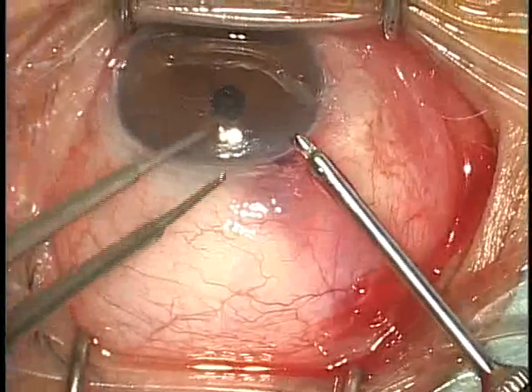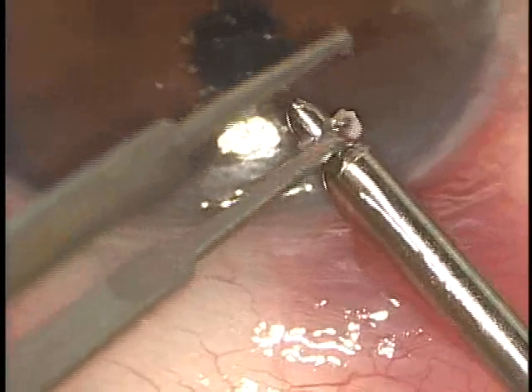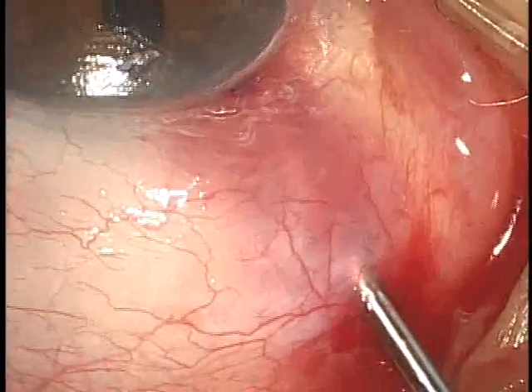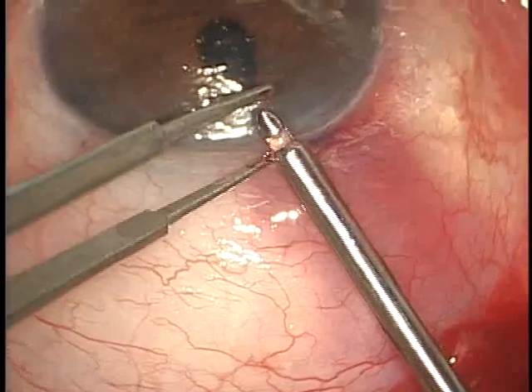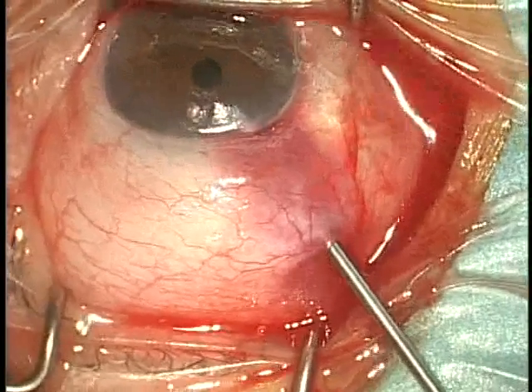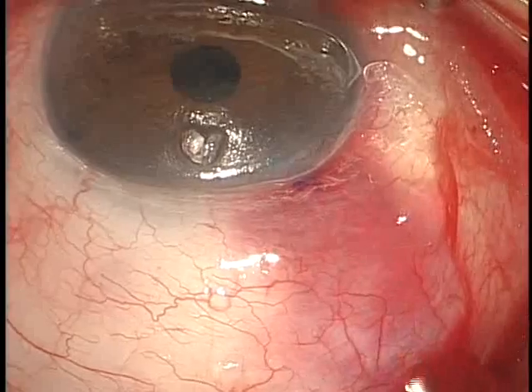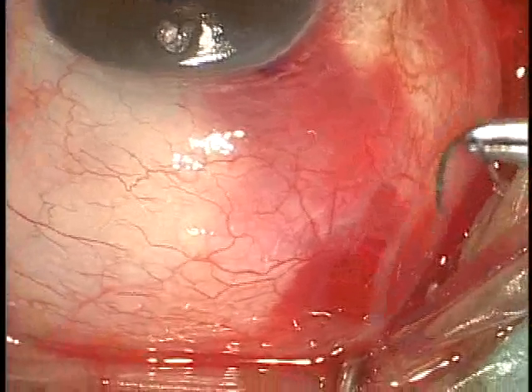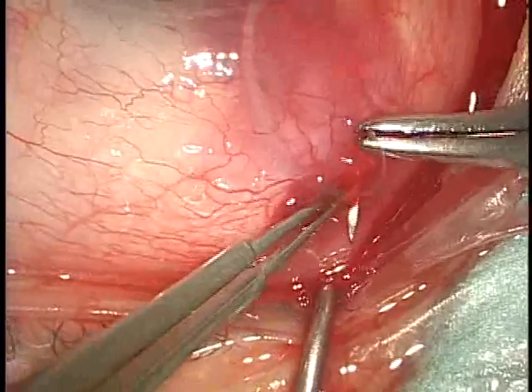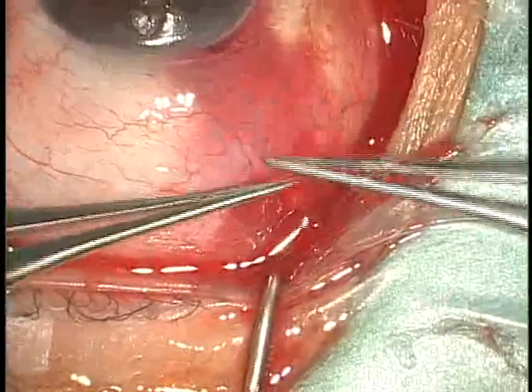The micro punch can control the size of the window with an adequate number of bites as needed to obtain the ideal reduction of intraocular pressure. If necessary, you can perform additional scleral bites easily. A 20-gauge vitrector creates a peripheral iridectomy through the 1mm incision, set at 200 cuts per minute and 200 mmHg vacuum. Finally, I close the 1mm peritomy with a 10-0 Vicryl stitch. This maintains the integrity and atraumatic condition with no leakage and some resistance to preserve ideal intraocular pressure.